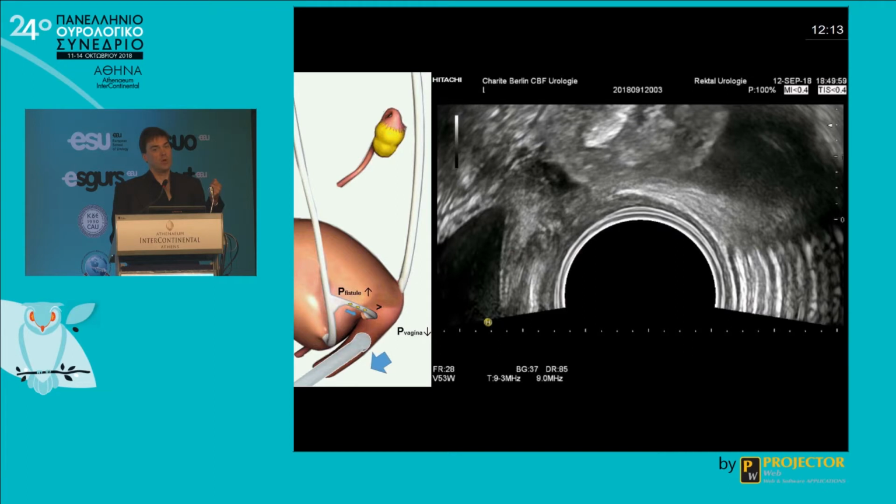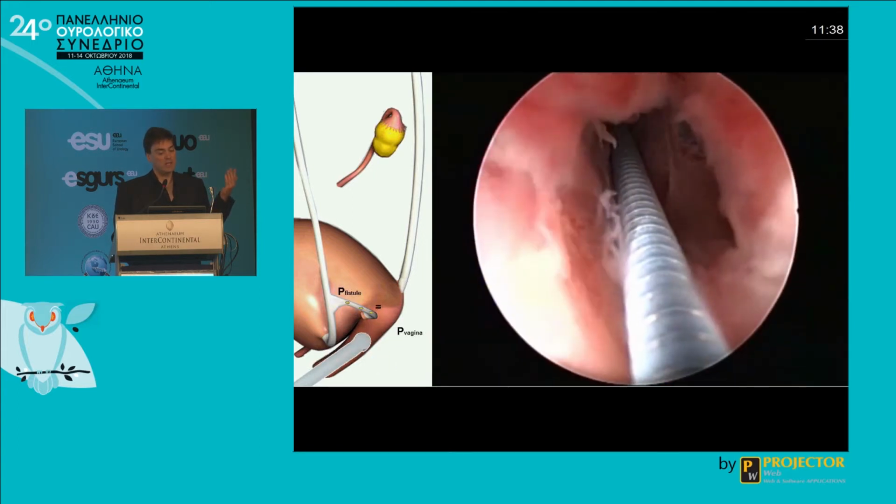With forward and backward, you see there's also a stent inside, but you see there's not correct suturing. There's a fistula between the ureter and the vagina, because before he preferred to do a laparoscopic hysterectomy, cut the ureter, suture it, but in ultrasound you can find with these techniques the fistula, and you can find also the material, and you see which kind of suture there is.